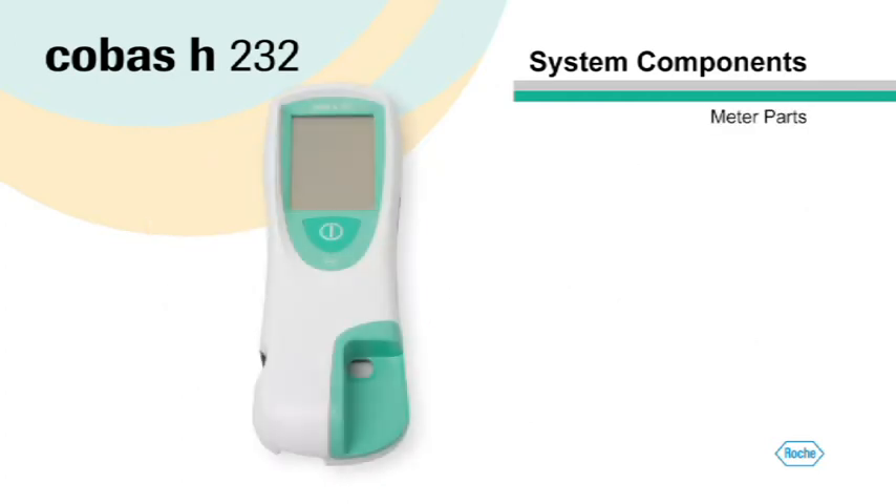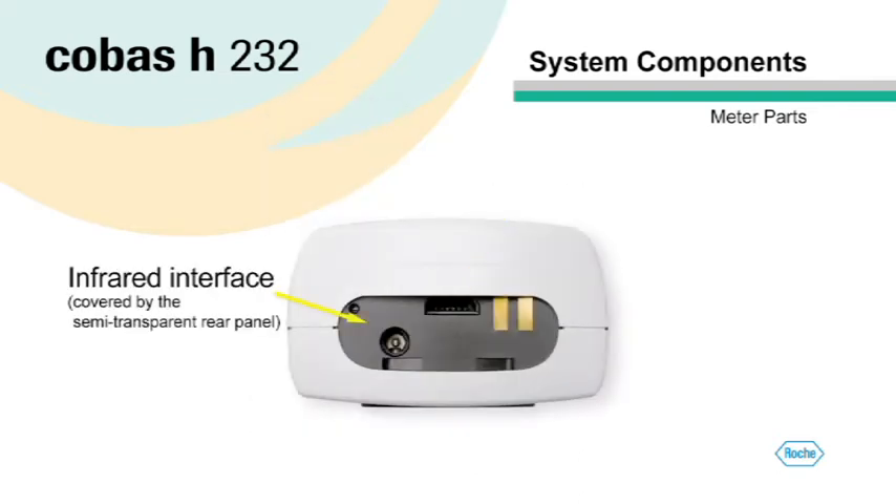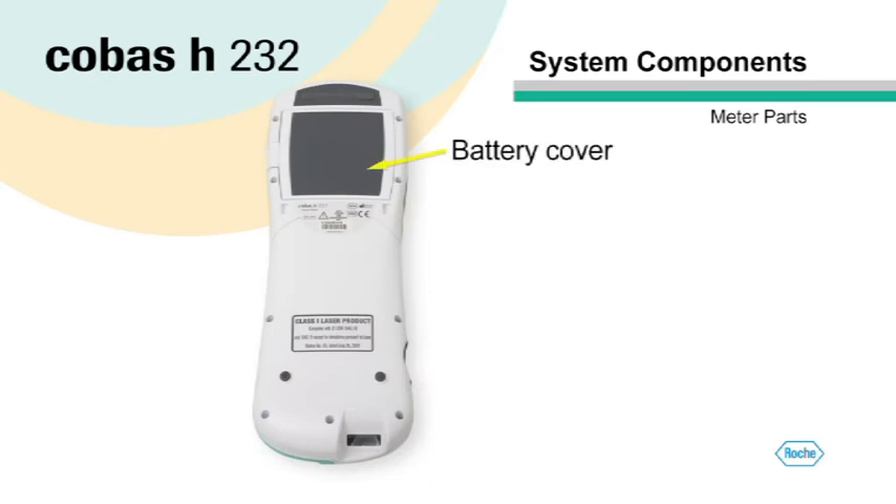Let's look at the parts of the meter itself. Here is the touch screen, the on-off button, the test strip guide, the measurement chamber cover, and the sample application area. On this side is the code chip slot, infrared interface, and the AC power port. On the back of the meter is the battery cover and the meter's serial number. On meters with the optional barcode scanner, this is found behind the scanner window on the bottom of the meter.